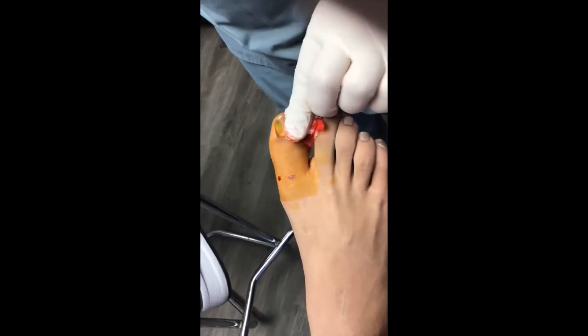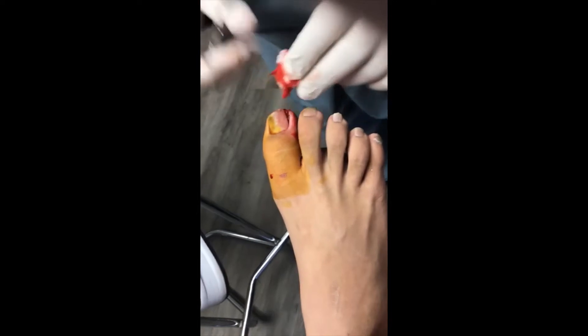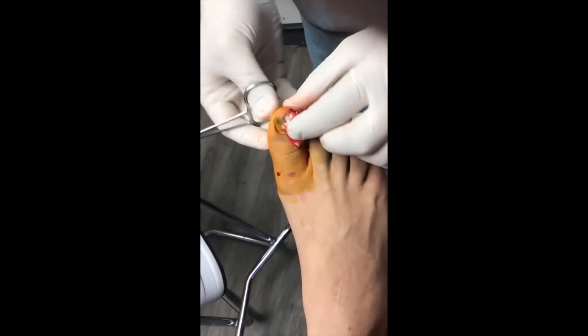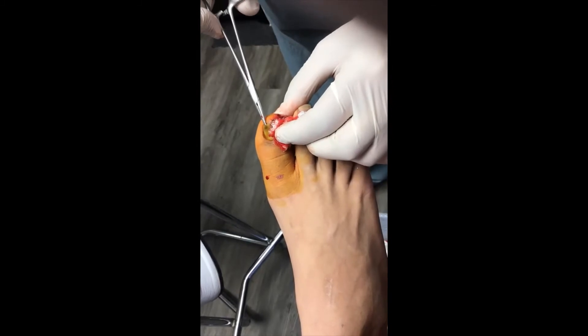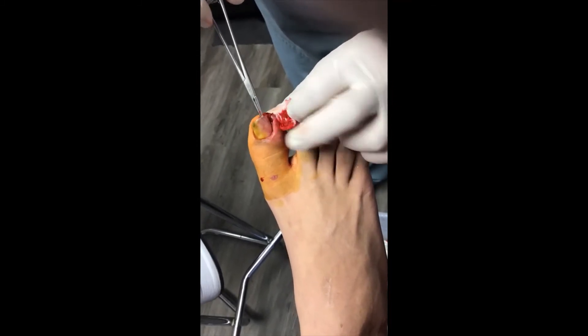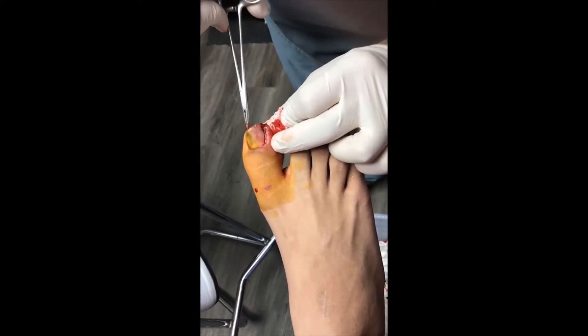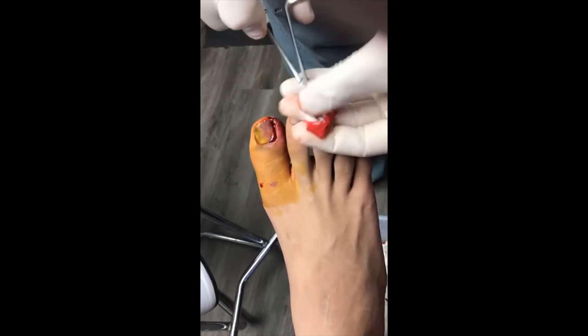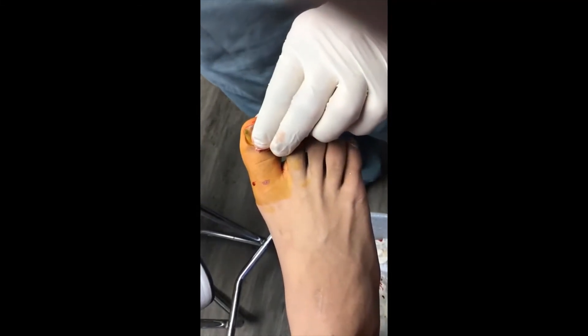All right, so you can see — I do not need to take the rest of the nail. You can see though, if I put the tool there, you can see where it's lifted but it's not the whole way. We're going to clean some of this gunk that's there, because this is actually fungus on the other side — kill two birds with one stone.